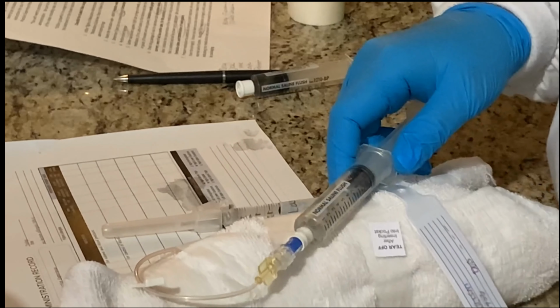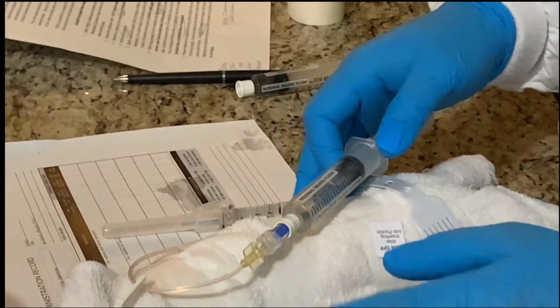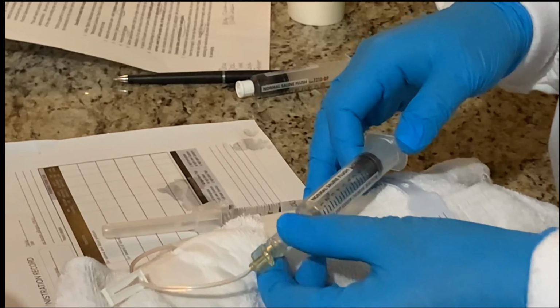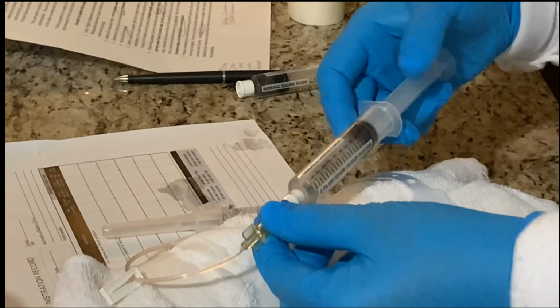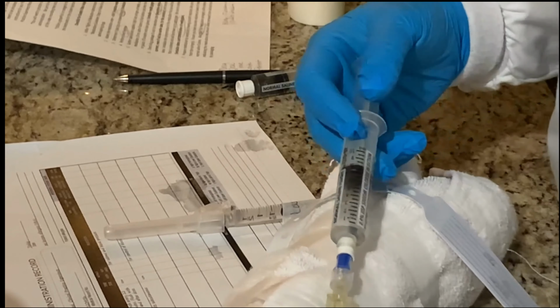Now, of course, you're not going to get blood return on a mannequin. I just used a bottle with a towel around it. You can use whatever you like. So I pull back, check for blood return, and then I'm slowly going to inject only 3 mLs. Of course, it's going to leak everywhere because it's not soaking up. Okay, you don't have to clamp this until the very end.